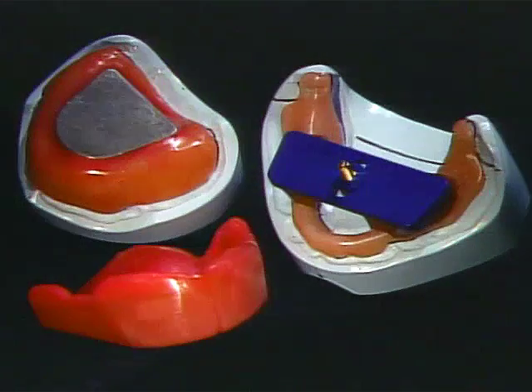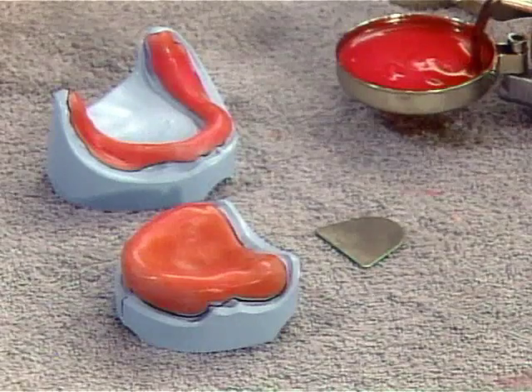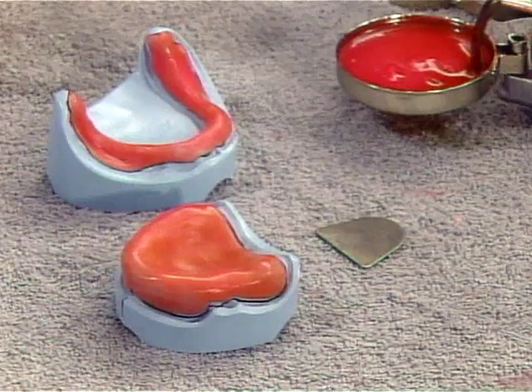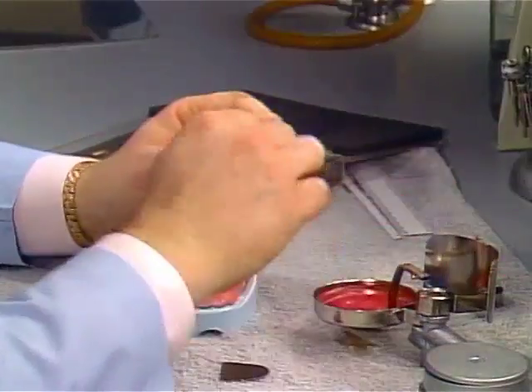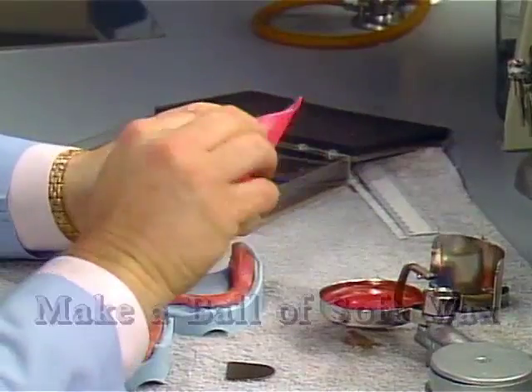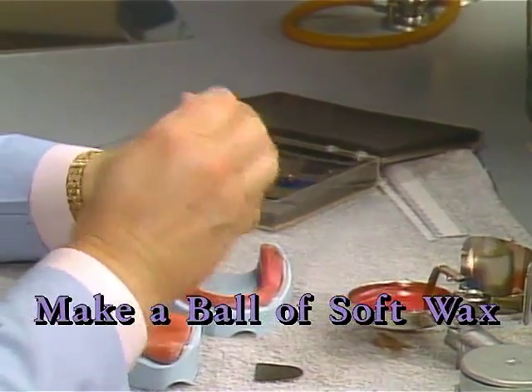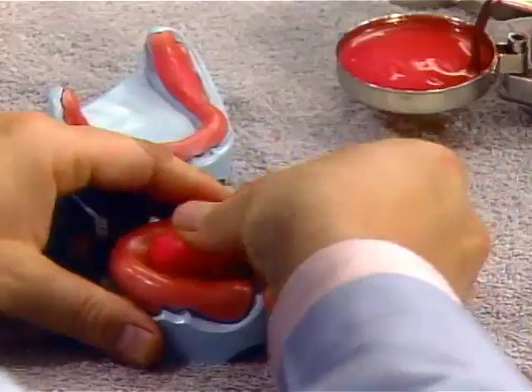When the dentist requests a bite recorder, you will also prepare an aesthetic control base for use in recording aesthetic measurements. To prepare the ball bearing bite recorder, use the materials in this kit. Prepare base plates for the upper and lower casts as you would for the aesthetic control base and the lower bite block. Thoroughly soften half a sheet of setup wax. Make a soft ball about the size of a walnut. Place the ball of wax in the palate of the upper base and flame the surface with a torch.